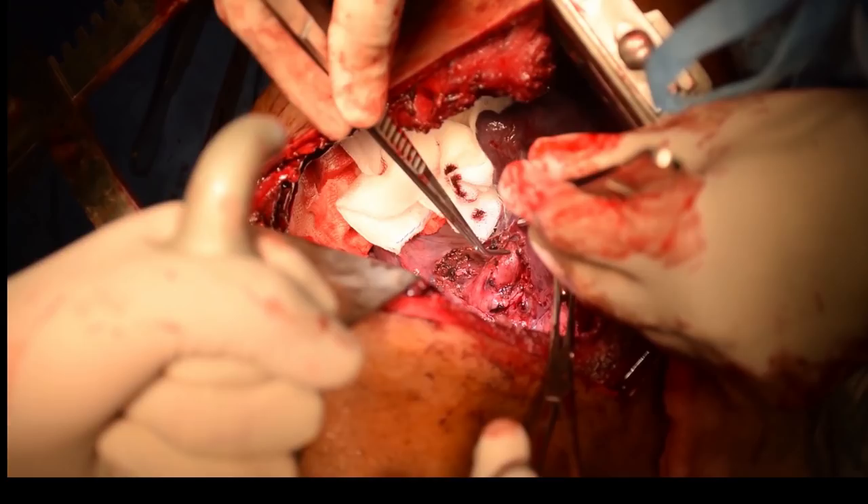First, the feeding artery was dissected out neatly. We made sure that the artery to the middle lobe and the artery to the lower segment of the upper lobe were not jeopardized — both were clearly visualized and dissected. The pulmonary artery feeding the lower lobe was looped, then divided between clamps and repaired with 6-0 Prolene.